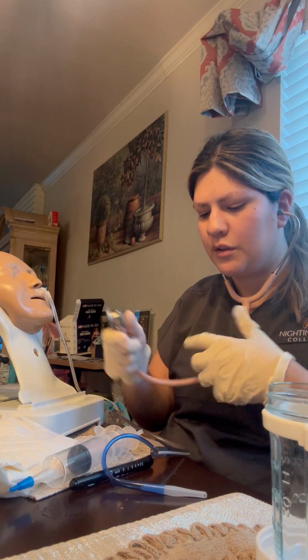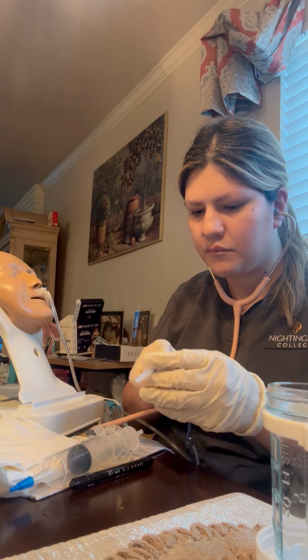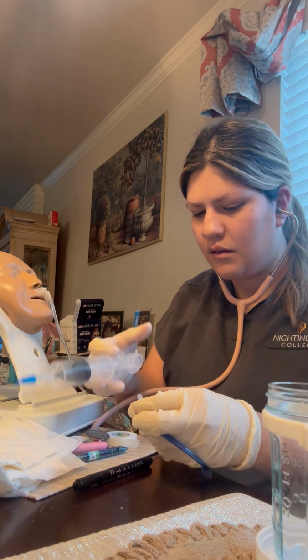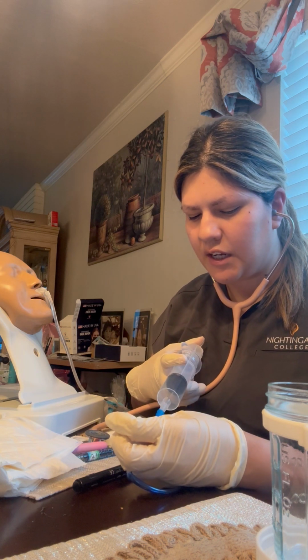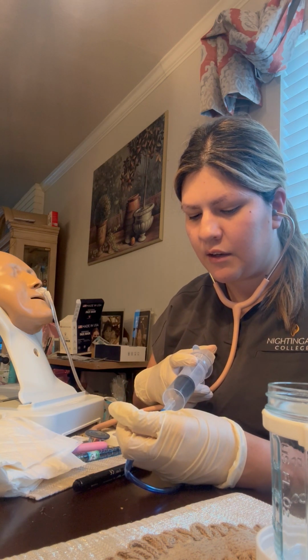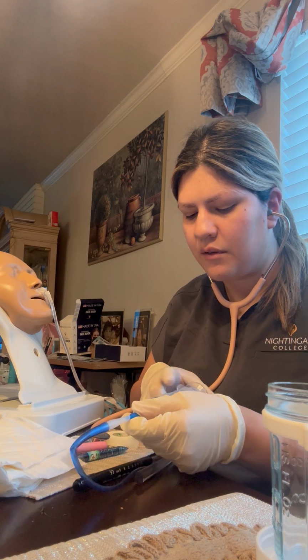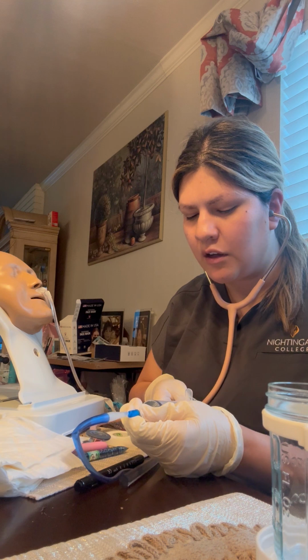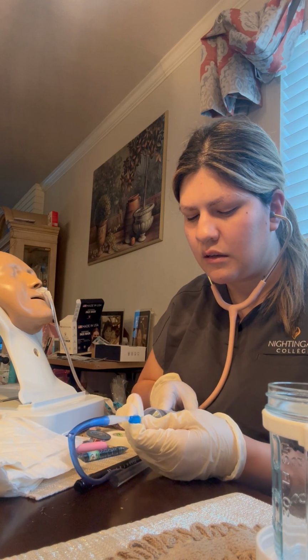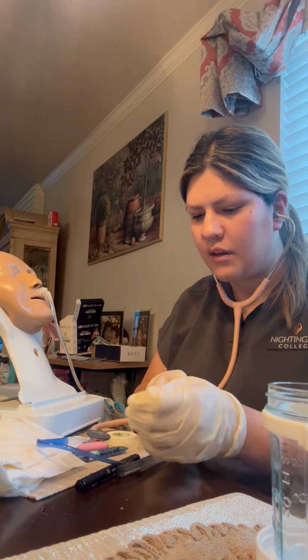So I'm just going to put this and I'm going to push in about 30 cc's of air. Okay, I heard a whooshing sound. Now I'm going to draw back 5 to 10 of stomach contents. Okay.